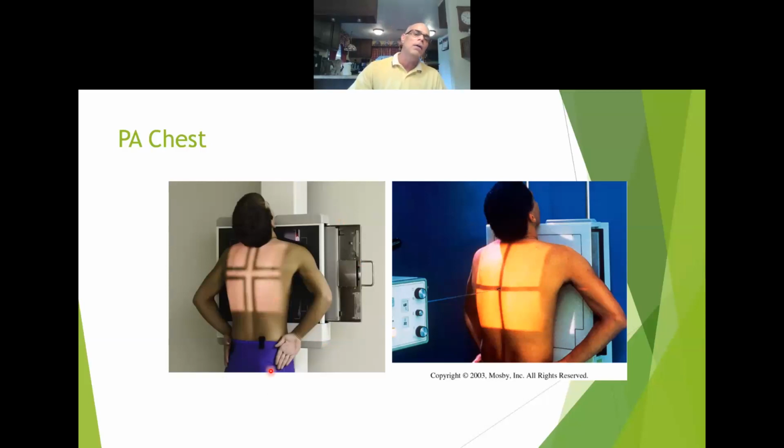I'm telling this guy here, all right, sir, in just a minute I'm going to get you to take a breath, blow it out, and take in a much deeper breath as I'm positioning. Do you understand? Yes.